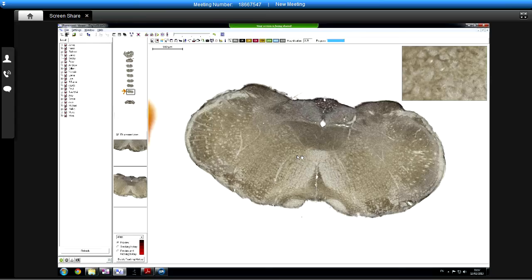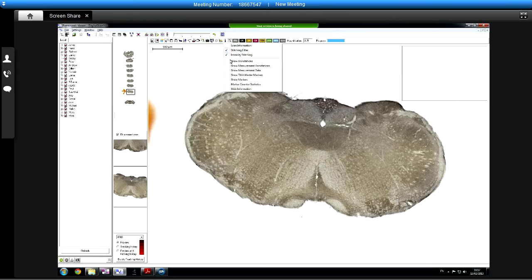No. I did try practicing on one of these, but tried to do the whole slide. It got to about 690, and then it just sort of froze. Yeah, one of the things to do is just stop it. Okay, interesting. It's better in my experience, even if you're doing the whole slide, to just take a minute to mark the bit of tissue, because all the bits in between, with bits of dust that you can't really see, still have to be processed.